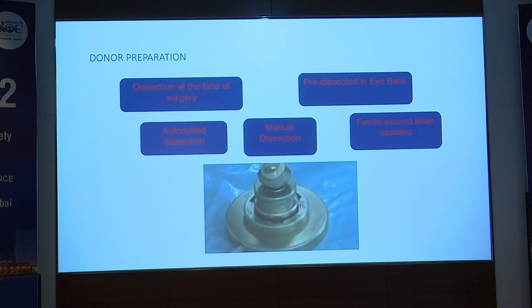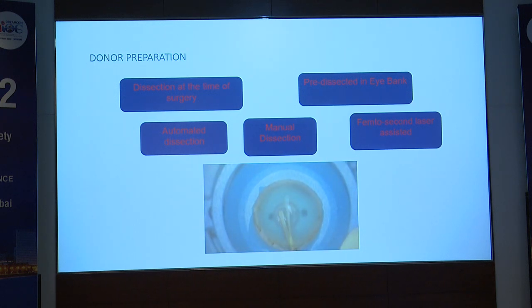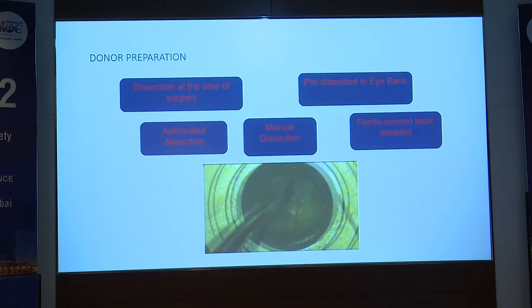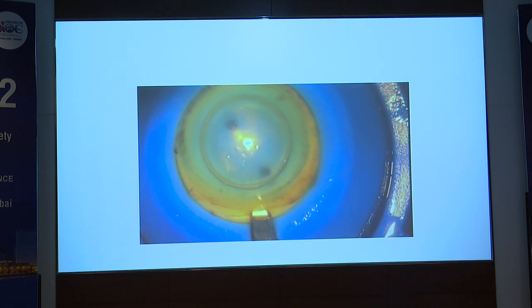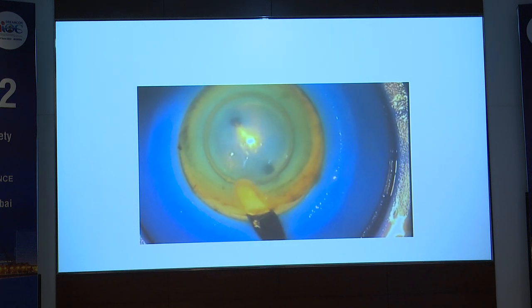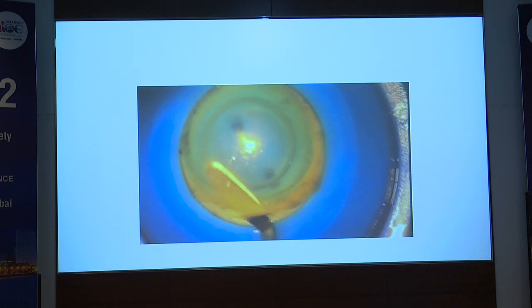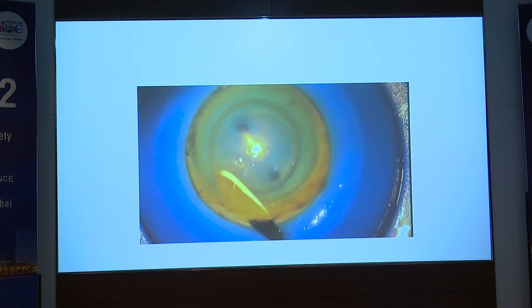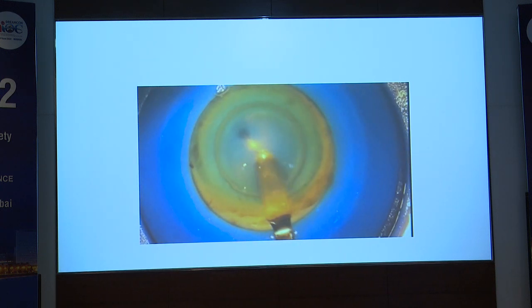The scleral rim should be adequate, with the shortest diameter more than 15 millimeters. Today we are really lucky that eye banks prepare and provide us dissected tissues. However, in case we don't have access to a pre-cut tissue, we can still dissect them manually, and even that does not require any special instrumentation. All we do is mount it on an artificial anterior chamber, pressurize it properly, make a 400 micron groove, and use your crescent blade to do a dissection, similar to the way you would do for an SICS.